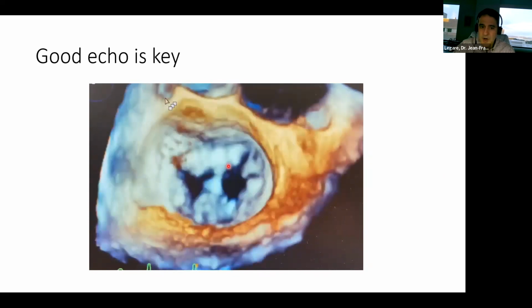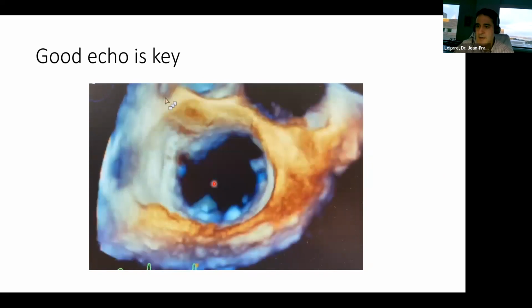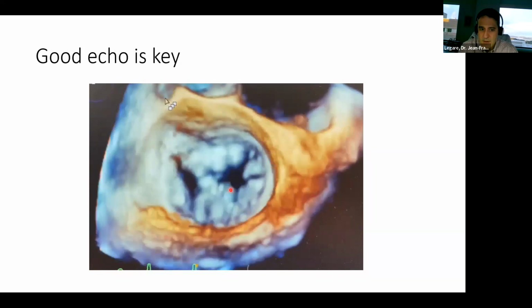And if you could put some color, you could see that the jet would be in that central portion. And viewing that all again from under, you can actually see the mitral insufficiency right in the middle. So this would be ideal from a clip point of view, right in the center, maybe even fixable with one single clip.